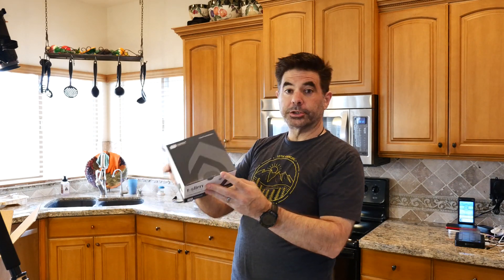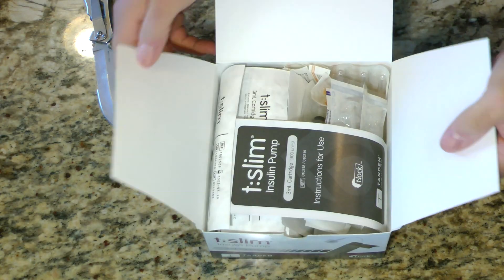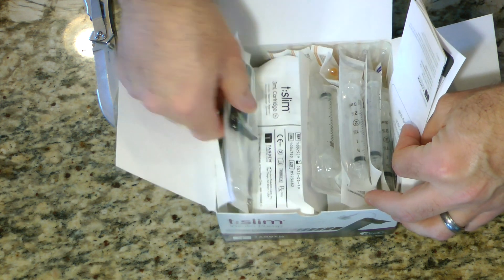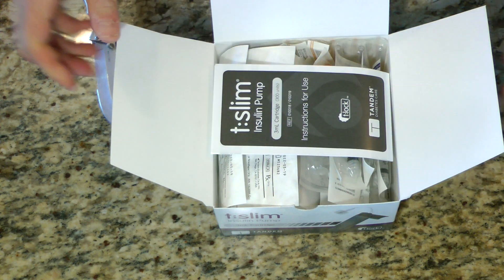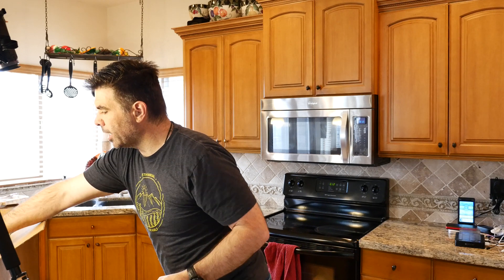Next are the cartridges — these are the T-Slim cartridges. This is a three milliliter cartridge, so let's open that up. There's a syringe, there's your cartridge right there, and instructions for use. There are three boxes of those.